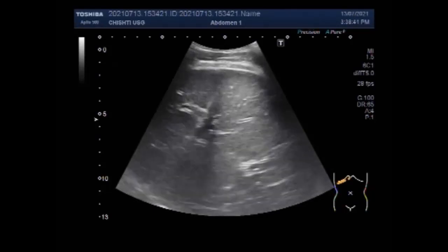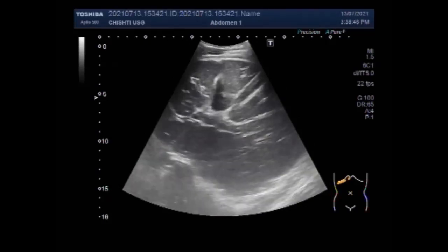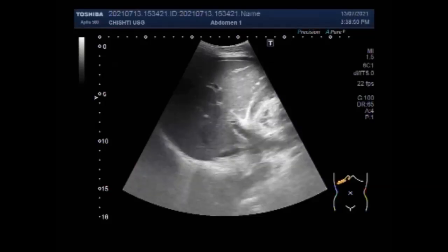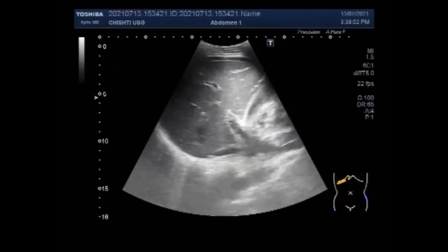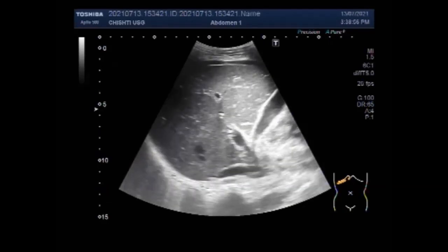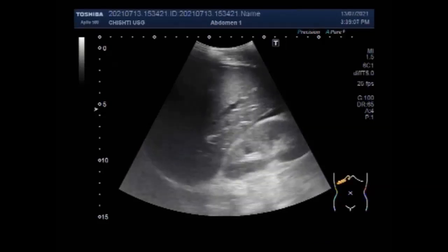You can see the liver and gallbladder, right kidney, a part of the right kidney in this position. The classical presentation of intestinal perforation is sudden and severe abdominal pain, sometimes with localized peritonism or a rigid abdomen on examination.